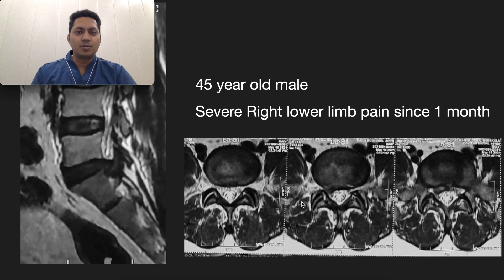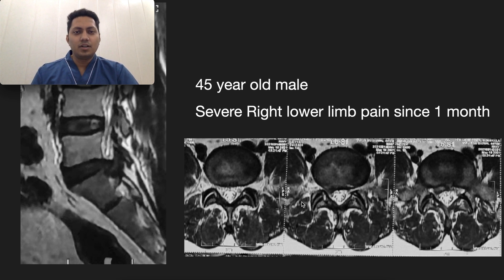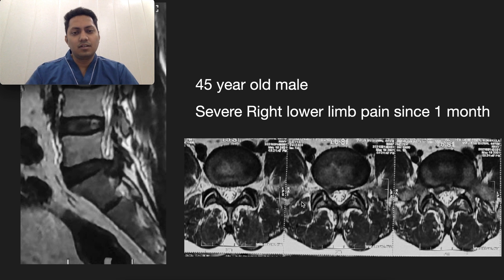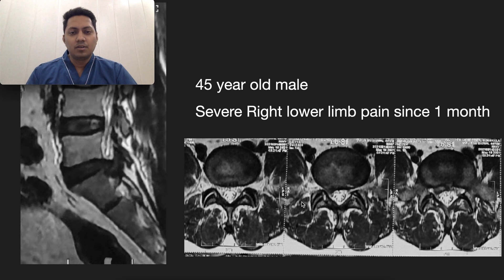Hello friends, I am Dr. Ankit Madhariya and today I am going to demonstrate a case of down-migrated L5S1 disc herniation in which we did an inferior oblique pediculotomy and foramintomy to access the down-migrated disc herniation.